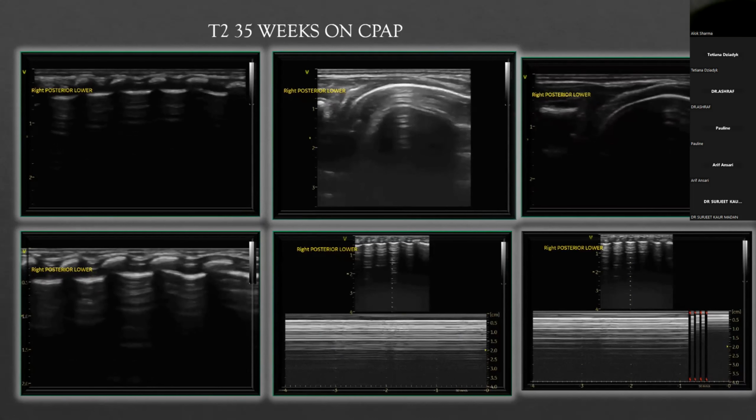So can you see this region here, and this region here? These are actually sandy beach appearances in between. You'll never get that if you get a true barcode sign. Again, you can see that over here as well in this entire area. So if you're getting an artifact like that, take your probe back off, make sure it's gelled, take it back on again. Decrease the frequency to get better depth.